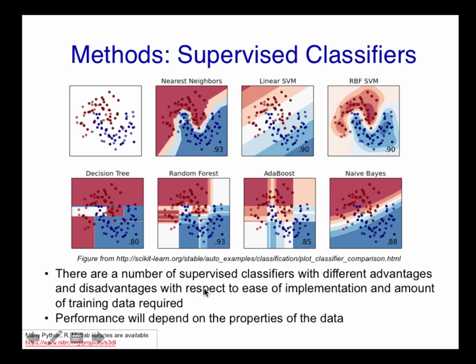So these different classifiers, there's some rules of thumb that could be used to help you decide on which ones to use, but lots of times people just like to try different ones. They're actually easy enough to use that we can try different classifiers and see which ones might perform best on your data.